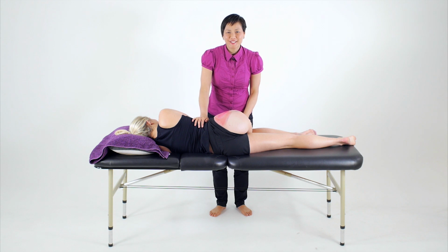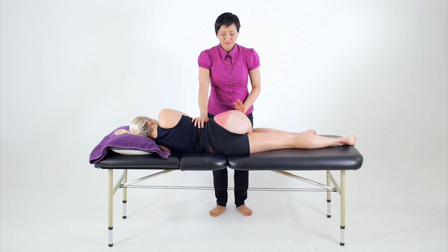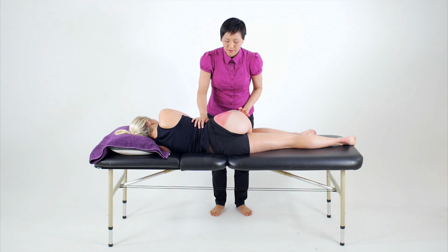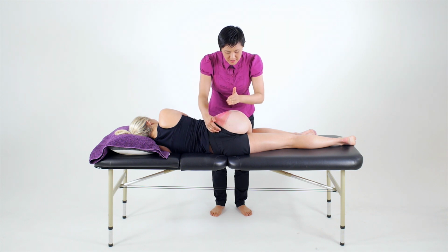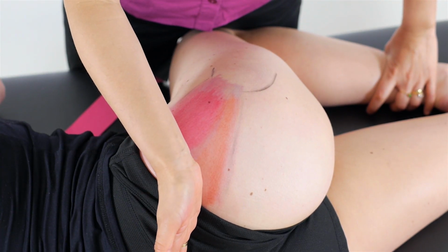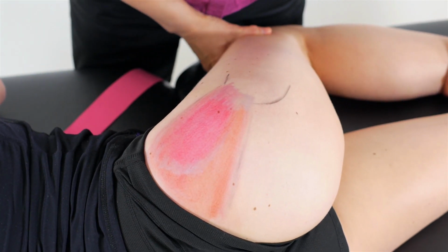For a strength application to the gluteus medius and gluteus minimus, we must first position the client in a lengthened position. So to position the posterior fibres, so the ones that we would have tested as being weak in abduction and external rotation, we'll consider the fibre direction and then position the femur in a continuation of those fibre lines. So as we follow these fibres, posterior fibres here, we position the femur just so it sits in continuation of that line to really lengthen the tissue.